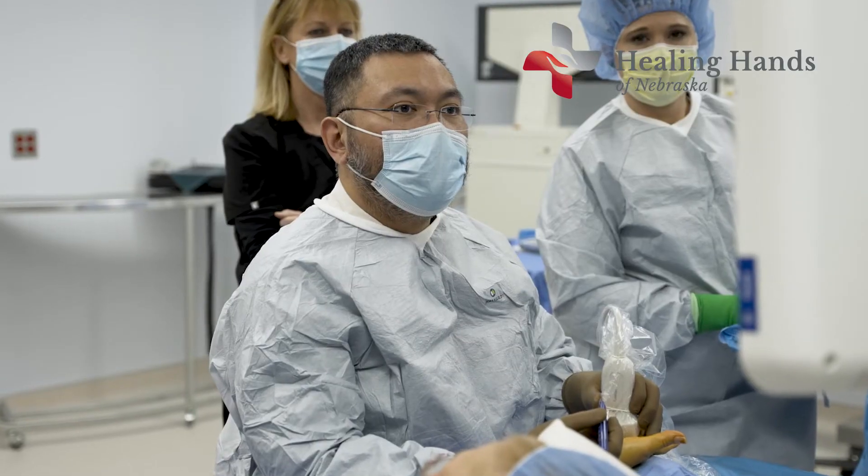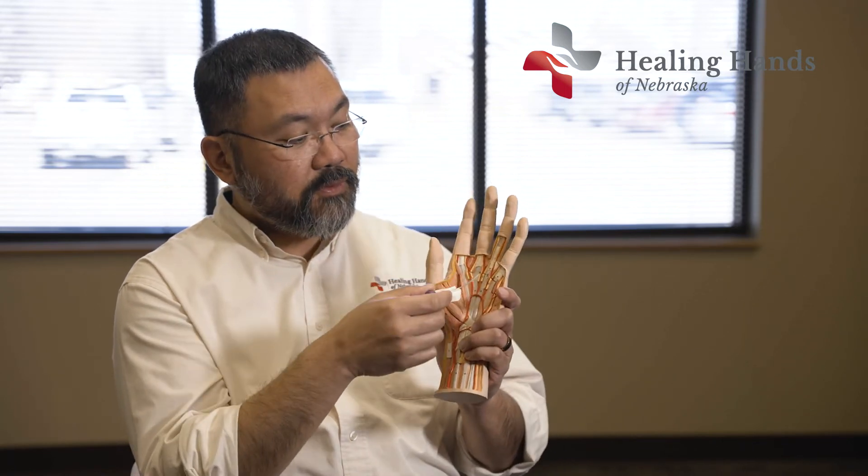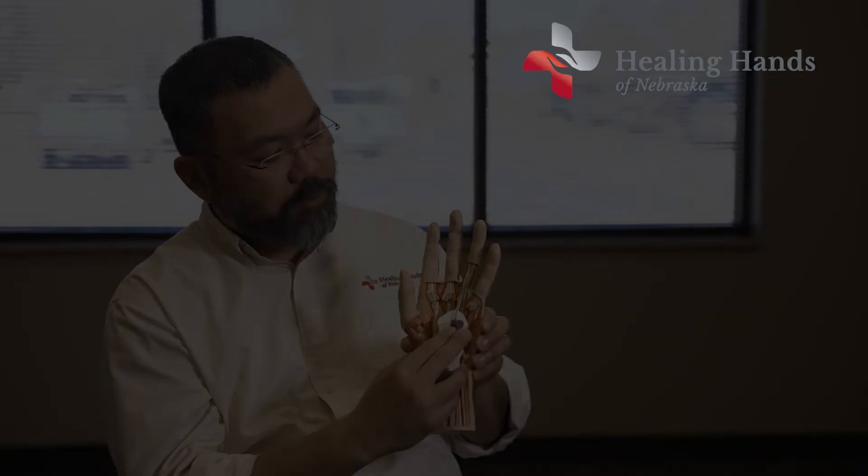We numbed up the hand, and using ultrasound, we were able to find that pulley. Then using this device — this is a sample — you slide it underneath the pulley, put the blade under, pop it up, and it cuts the pulley. That's the whole procedure. You put on a little bit of surgical glue — no stitches — because the incision is barely bigger than the device itself, not as wide as your whole finger.